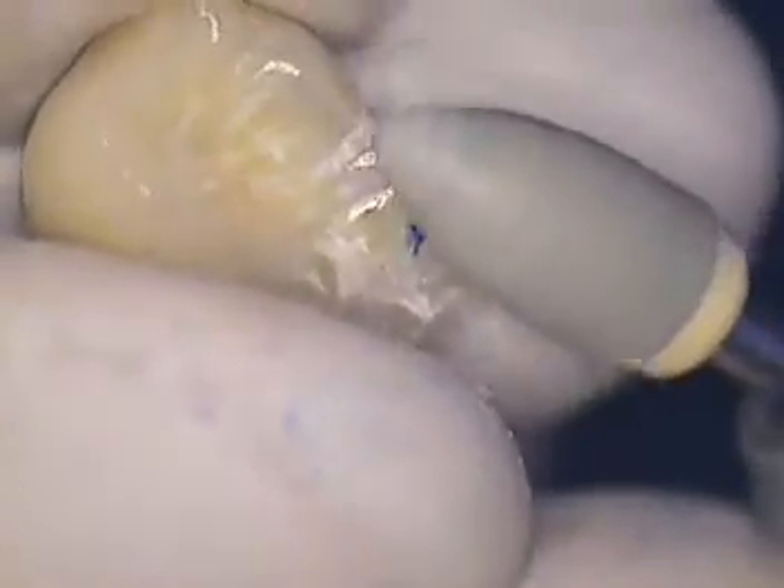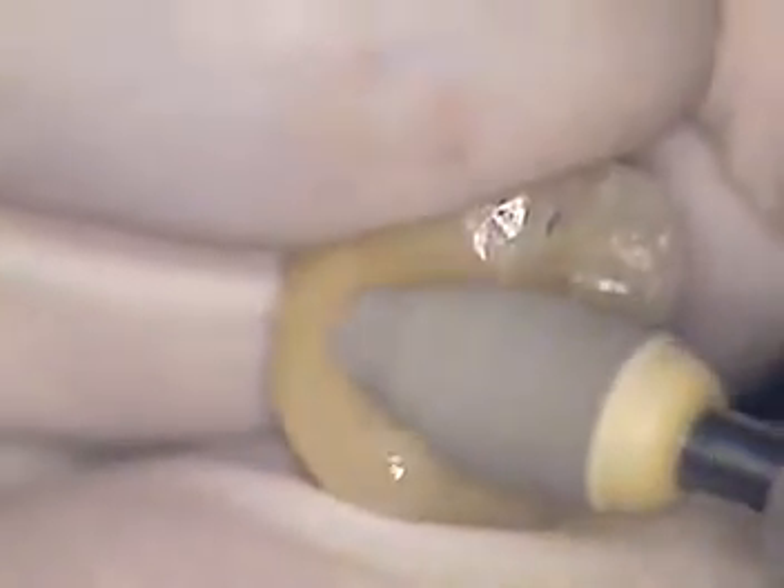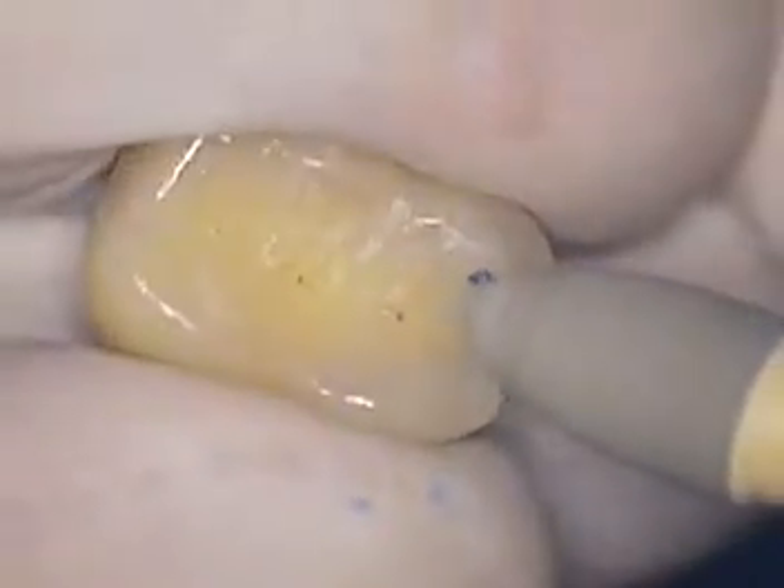Here's my final polish on my implant crown, and we're doing great. There's the underside and it's got a nice clean look to it. We'll just dry that off now. I'm going to polish that a little bit more. So that's the polishing.